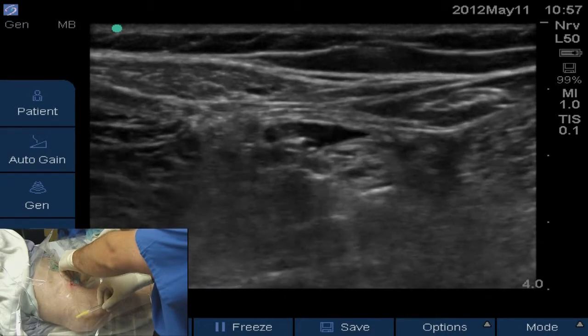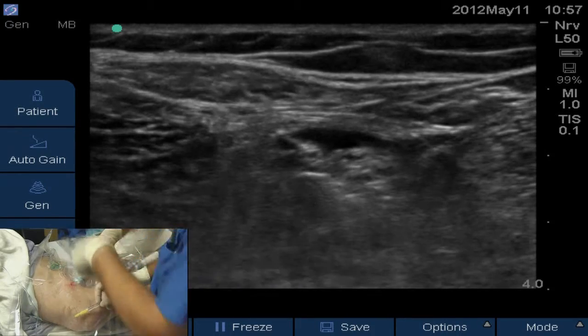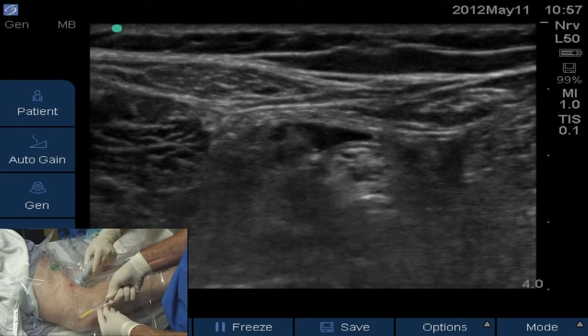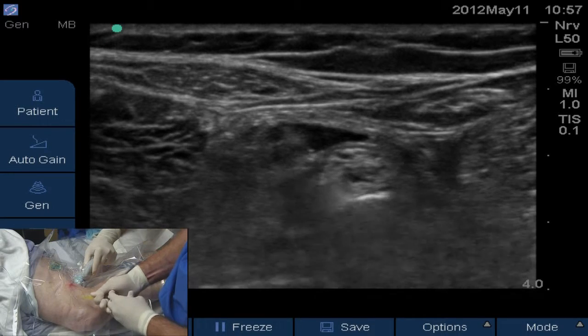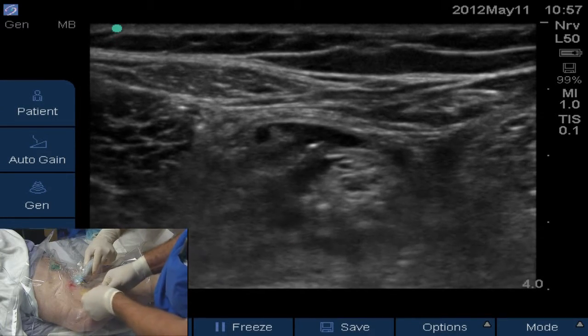That looks like a pretty good spot. You can see the air at the 5 or 6 o'clock position underneath the tibial nerve, a little bit more distal down the leg. We'll inject some local anesthesia after aspirating negatively for blood. You can see the tibial nerve moving considerably as a result of that injection — we're happy with our location.